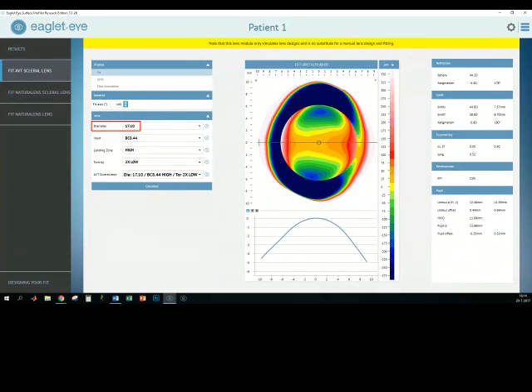It's picking you the side of the lens just based on the cornea. You see right now it's picking a flatter lens because we're not dealing with an irregular eye, and it's giving you the advice for picking a high landing zone with a toricity with a 2x low. So that's almost the highest toricity which is offered by AVT.